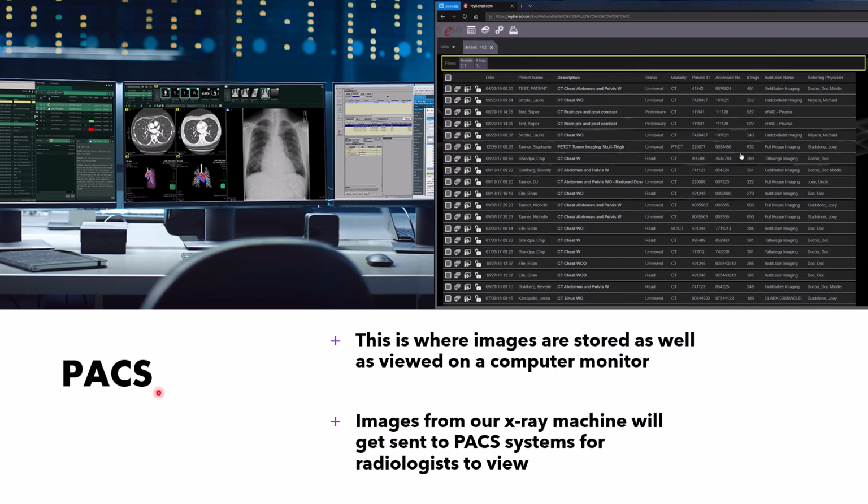If you're in the same PACS system with me, for example the Memorial Hermann system, if I had an X-ray at Memorial Hermann Southeast, I could see that if I was at Memorial Hermann Medical Center, if I had the patient's correct information, because all of that system uses the same PACS. I cannot see something in another system unless they send it to me and I download it to my PACS.